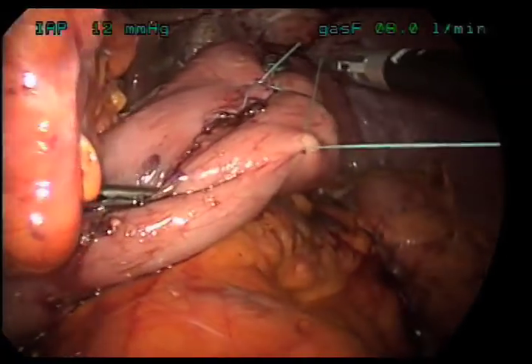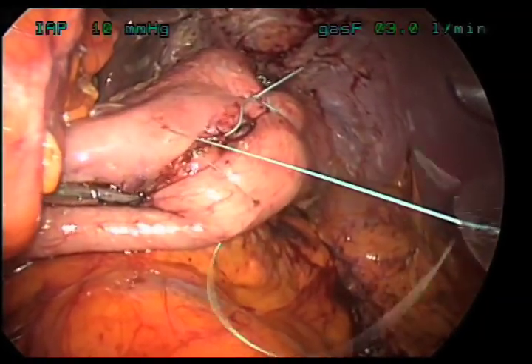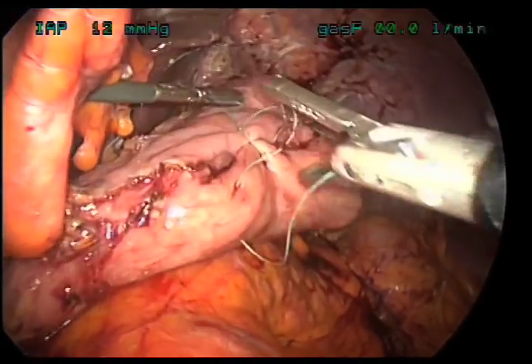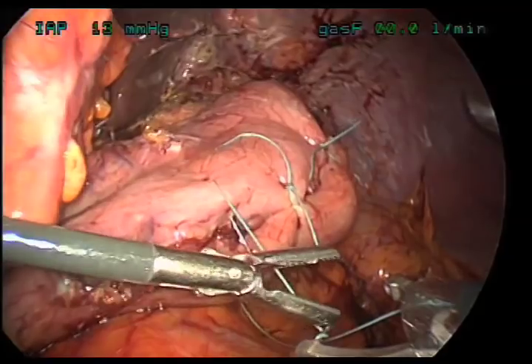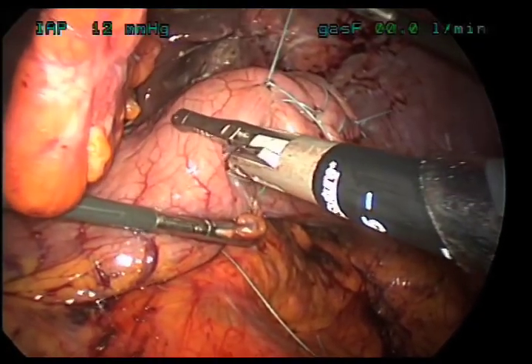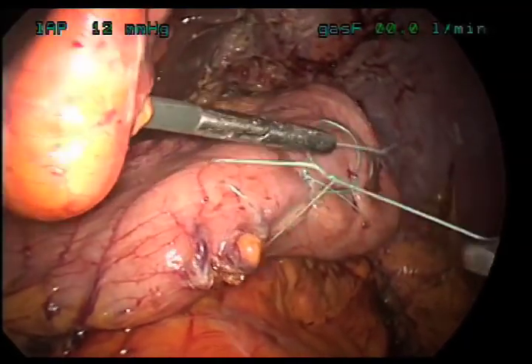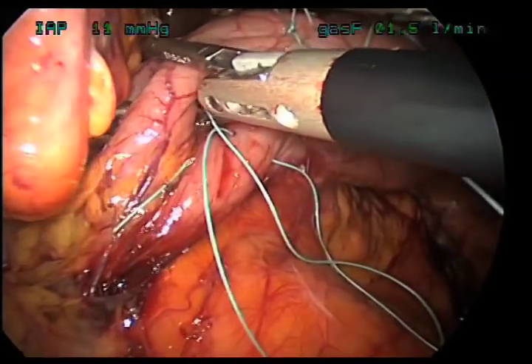Here's another bite, taking full thickness through the stomach, and we're going to fold that greater curve in on itself once more. One more bite, and we're going to continue this down quite a ways so that the stomach through its entire length — which normally expands on a big meal — gets plicated in so it can no longer expand for a larger meal. This is different from the sleeve gastrectomy in the sense that it is reversible. To reverse this procedure, I would simply go back and remove all the sutures placed in the stomach, making the procedure totally reversible.